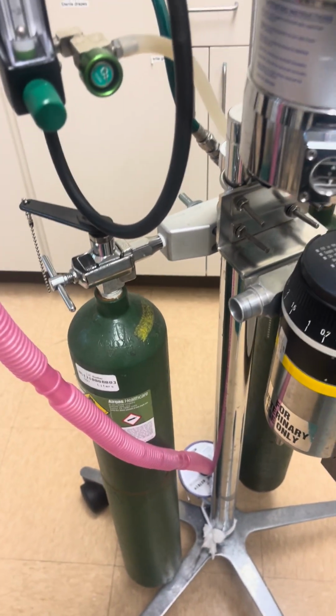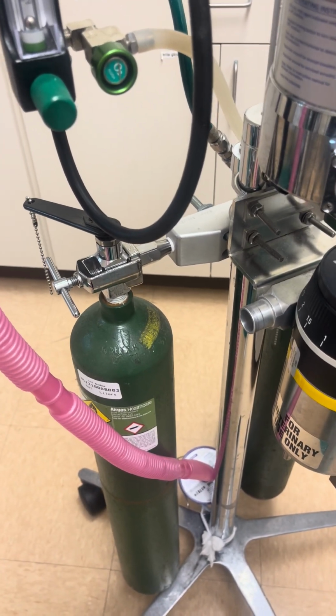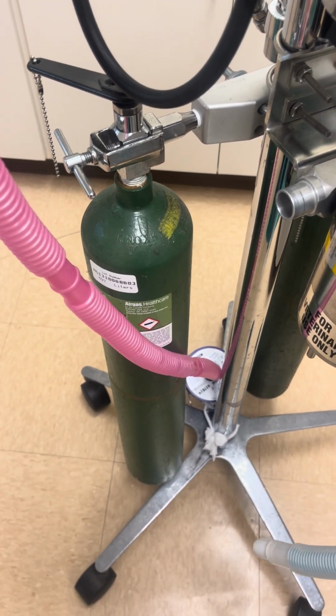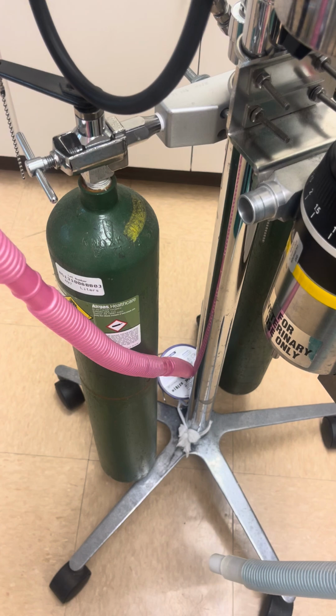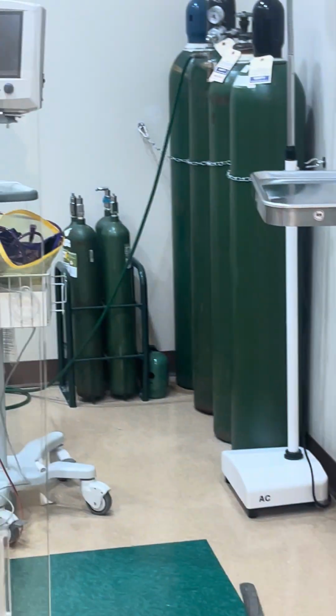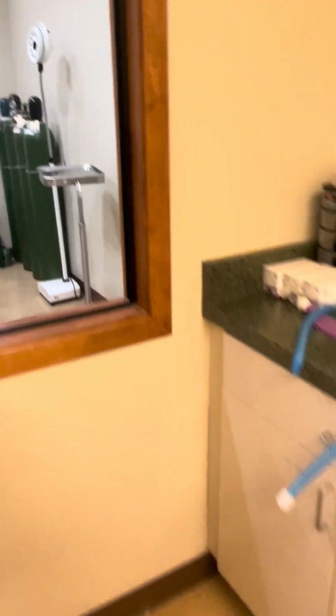These are your E cylinders. They're small, they're portable. These attach to the anesthesia machine and hold about 700 liters. There are bigger ones. Those are the H cylinders.